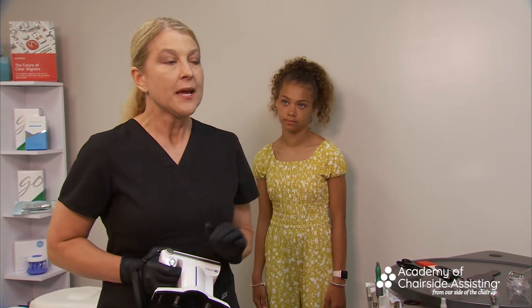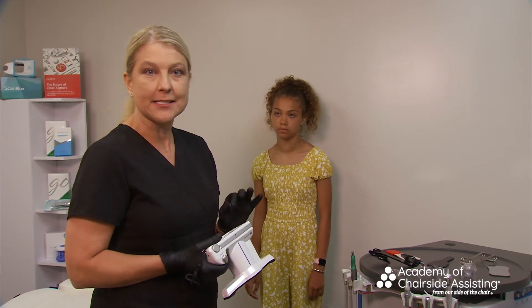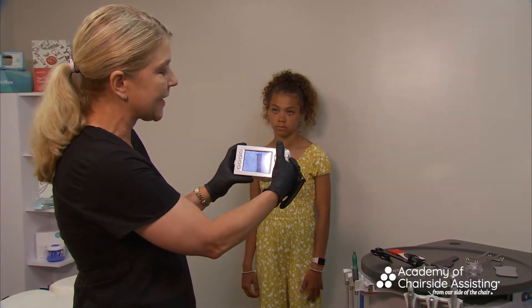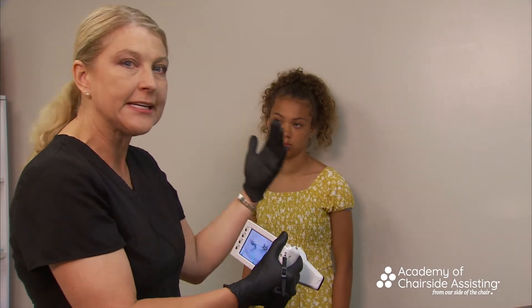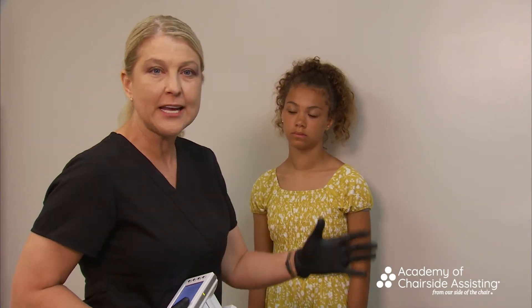We'll start with full face photos and I'll give you troubleshooting along the way. The Shofu camera is touchscreen, which makes getting the right settings easy. For framing, this is not a full-body shot — I always get from the shoulders up. I don't want to cut off the top of her head, and for accreditation they like to see the chin up, but I always want to see the shoulders.